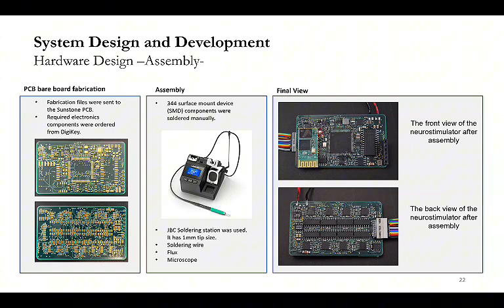In current technology, you can get an all turnkey solution. Basically, you can submit all the fabrication files to the PCB companies, send what they call a BOM file, a bill of materials file, and then they complete all the assembly and return it back to you.